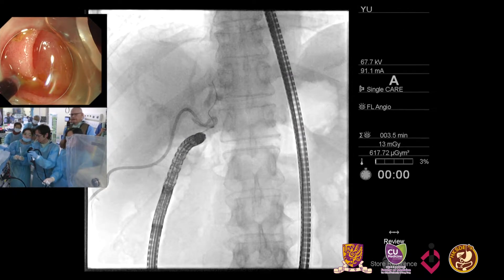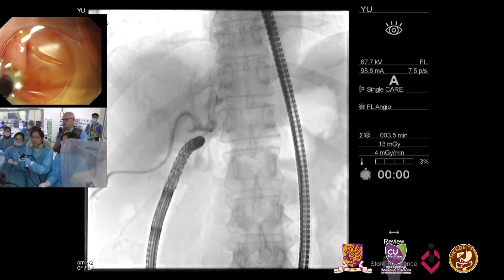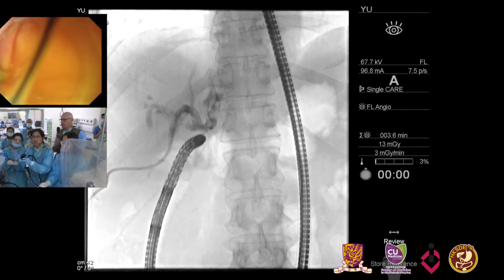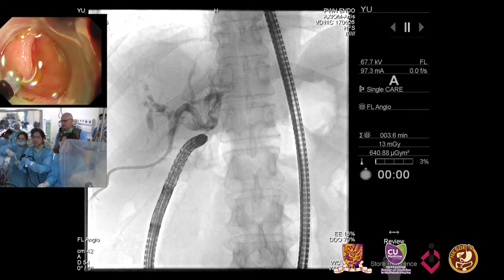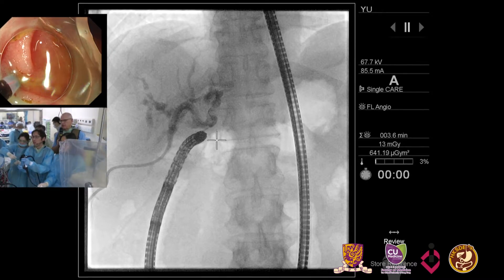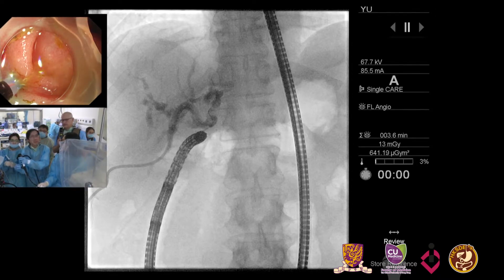Off camera, we found an orifice that we thought was the bile duct, but it was actually the pancreas — a nice opportunity, as generally in Whipple patients I don't ever find the pancreatic duct. Once we found it, we came back and you can see that it's stenosed — it barely allows the bullet-tip catheter to go in. But we're now filling the biliary tree. Shall we proceed to balloon dilation? Yes, let's do that.